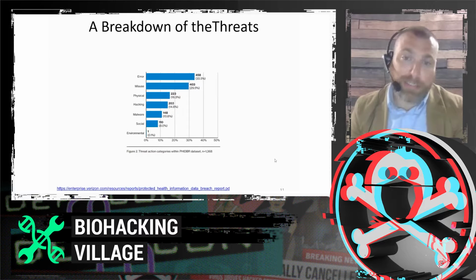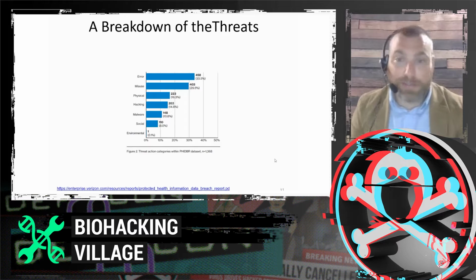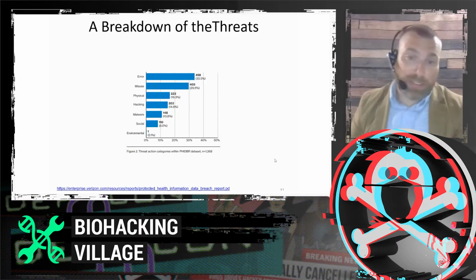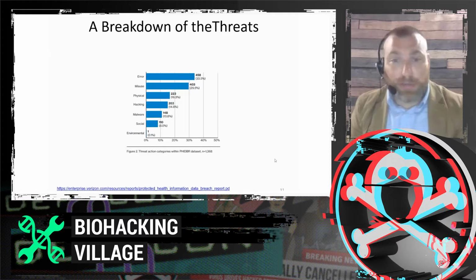Misuse would be the second highest, just under 30%. Misuse in this case would have a deliberate component. So, it could be as simple as nurse A tells nurse B, hey, did you hear about this patient? And nurse B shouldn't have access to that patient, or it could be selling hundreds or thousands of records. So there's a broad spectrum there. Physical, we'll touch on a little bit.